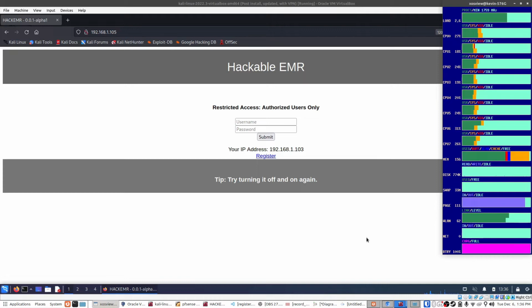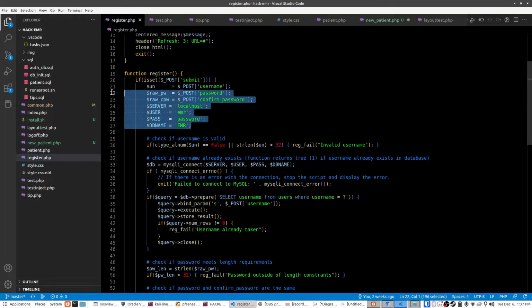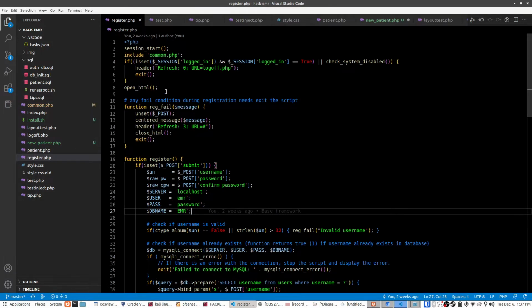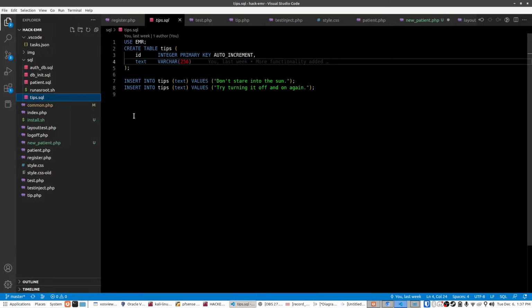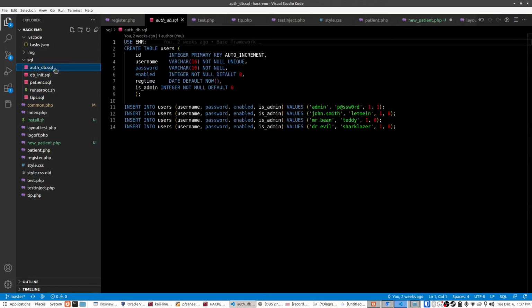Part of that is due to the implementation, so the code itself does not adhere to best practices in basically any way, and includes things like hard-coded passwords for the database that are repeated multiple times in different files, creating a duplication problem, improper use of sessions and session cookies, and other things such as no sanitization of query strings and stuff like that. Other insecurities have to do with the database itself, in that there is no privilege separation between the different tables of the database. So if you hack one of them, you can hack all of them.